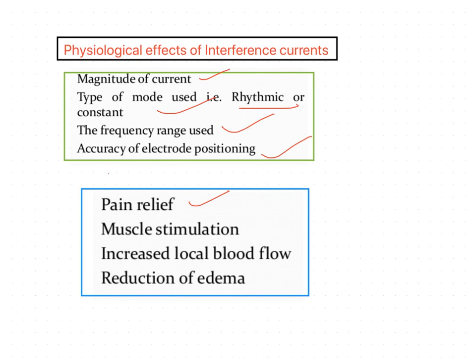And also a frequency of 80 to 100 hertz rhythmic is usually chosen for the effect as the problem of accommodation is reduced. So 100 hertz may stimulate the large diameter fibers, which have an effect on the pain gate in the posterior horn. That means it is going to suppress or inhibit the transmission of small diameter nociceptive traffic.